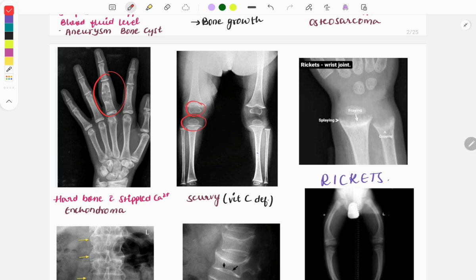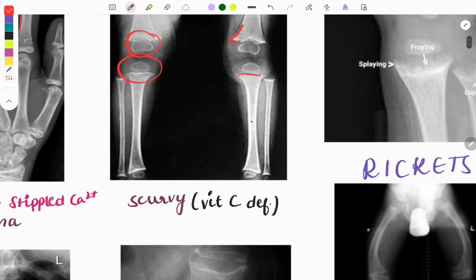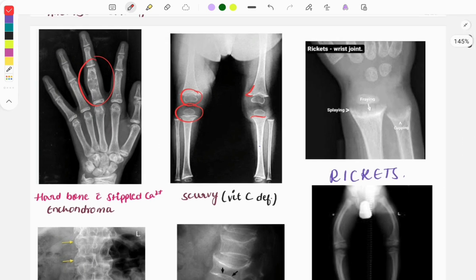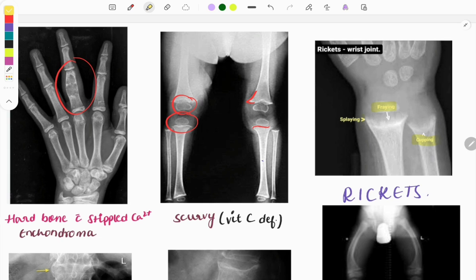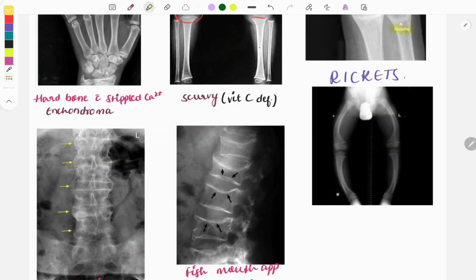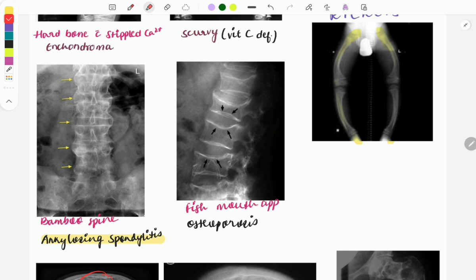In scurvy you can also see the Pelican spur, the Trümmerfeld zone, and Frankel's white line — these are important findings. Moving on to rickets, you can see classical findings like fraying and cupping. Rickets is usually due to vitamin D deficiency; this is an X-ray of the legs showing bowing of the limbs, also called genu varum.